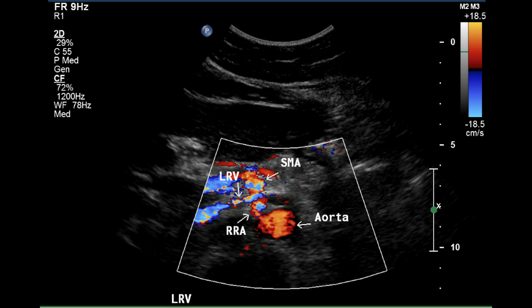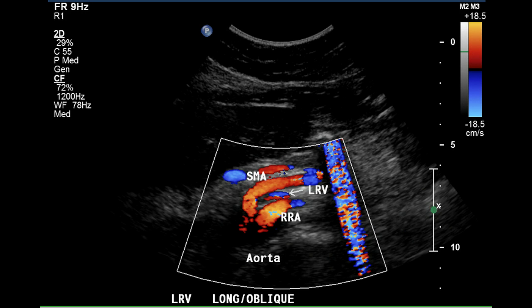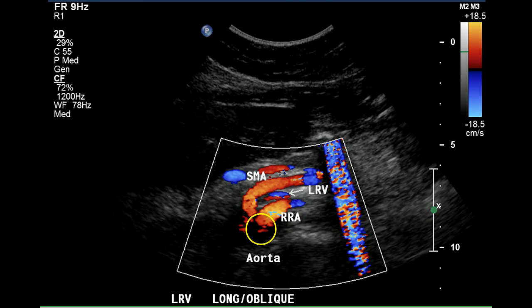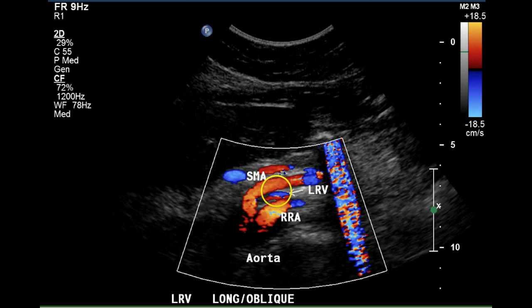The origin of the right renal artery can be demonstrated on this image. It appears to have a slight tortuosity. The SMA, right renal artery as it enters the aorta, and the left renal vein coursing between the aorta and SMA can all be demonstrated on this sagittal section.